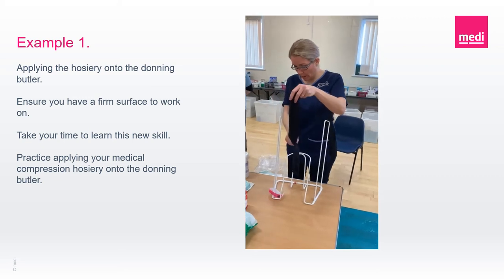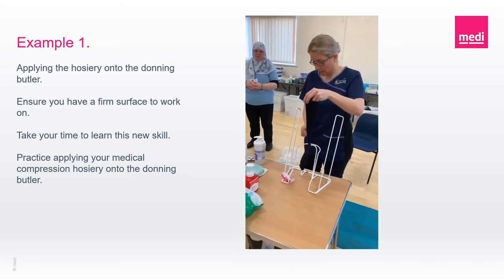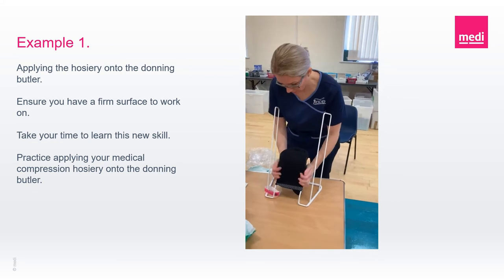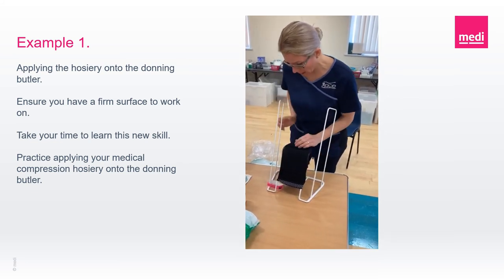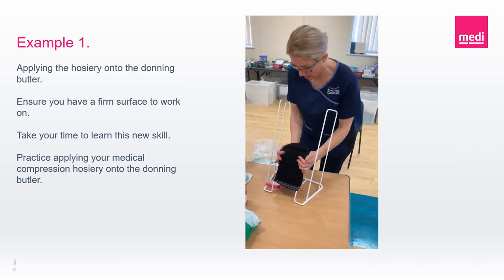So remember: frame to your belly, heel at the back, and then you just roll it down until you get to the heel, and always remember your seam will be down the middle.